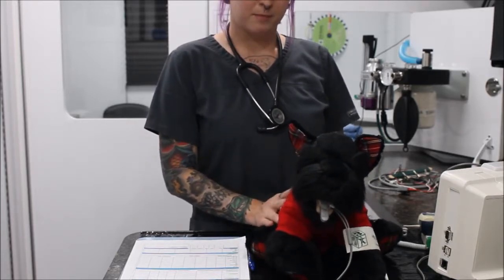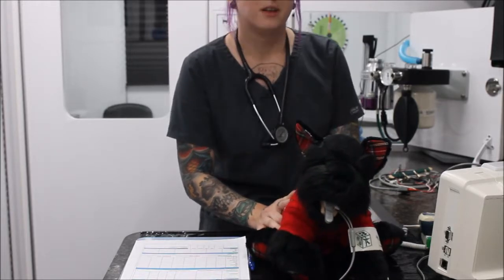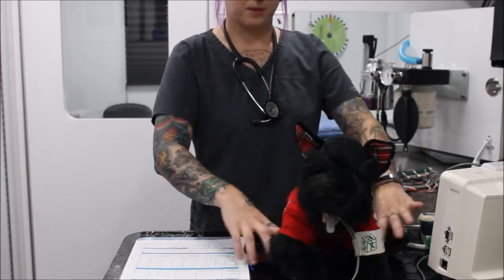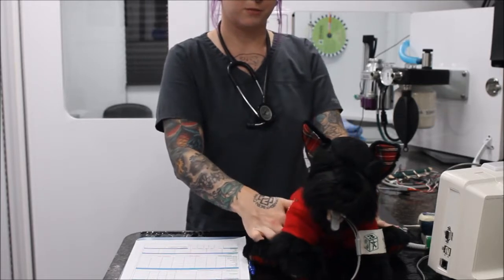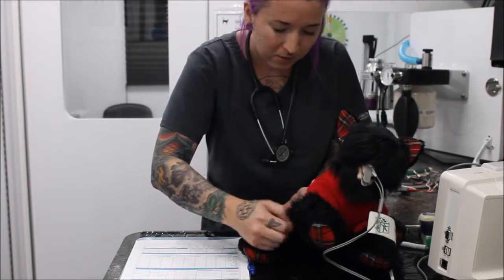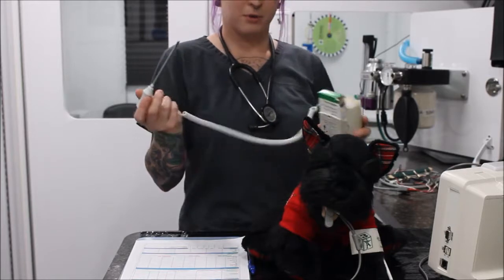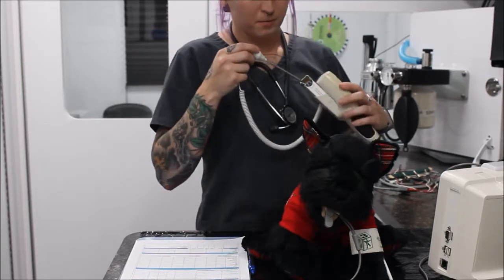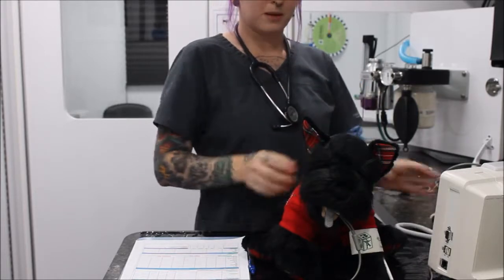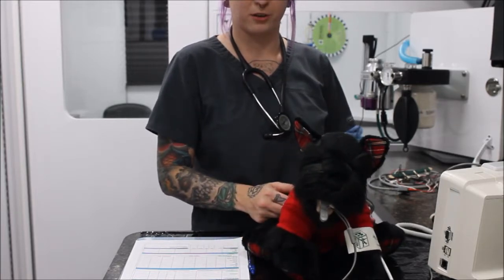So another parameter that we measure during anesthesia is temperature. Temperature can tell us quite a bit. If the temperature is too low, then they become hypothermic and they might not be able to absorb the anesthetic drug all that well. So we monitor temperature basically throughout the entire procedure by leaving the monitor with the probe on our patient. Normal temperature for a patient under anesthesia is usually about 97 to 100 degrees Fahrenheit.